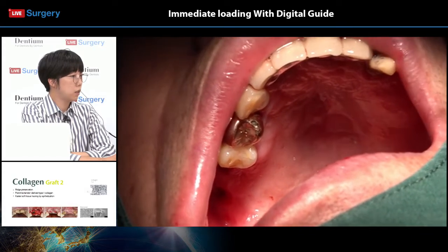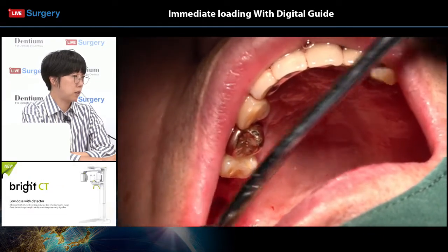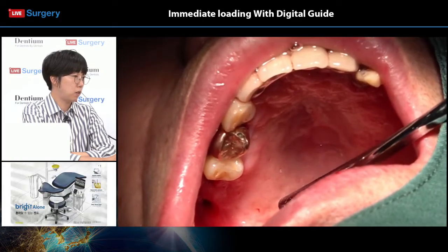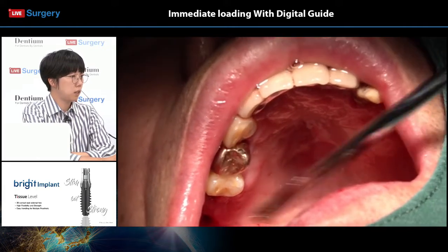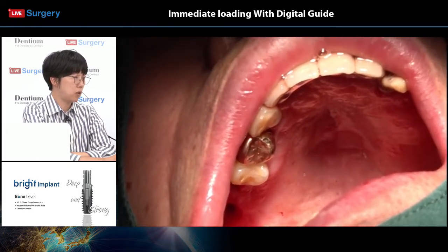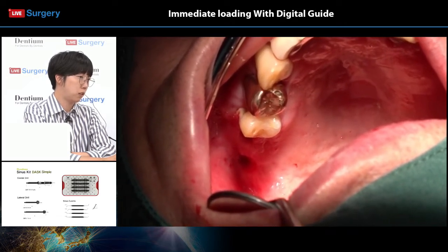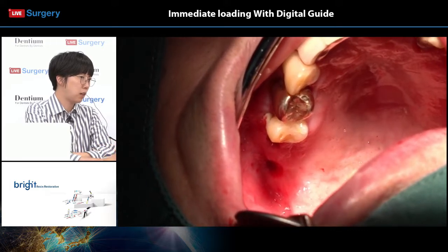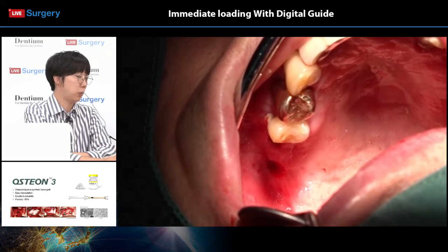I think he might just start reflecting the flap because there isn't a sufficient amount of keratinized gingiva on the buccal, and I think the initial stability on the number 17 area would be a little tricky. And the mouth opening of the patient, I don't think it's wide enough compared to other patients.